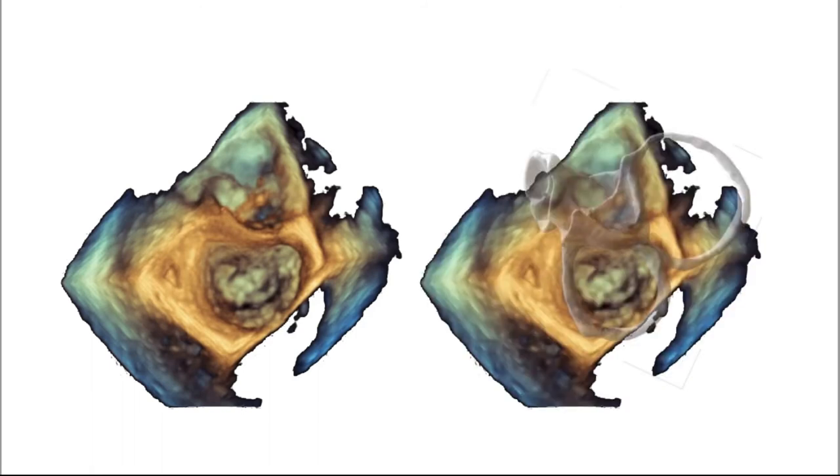This is a very similar data set, similar position. So I'm going to try to picture how the heart base is positioned here, and for example, which way you would have to rotate the probe to see the tricuspid valve. That's almost the same as the last one. This one is a bit more challenging.